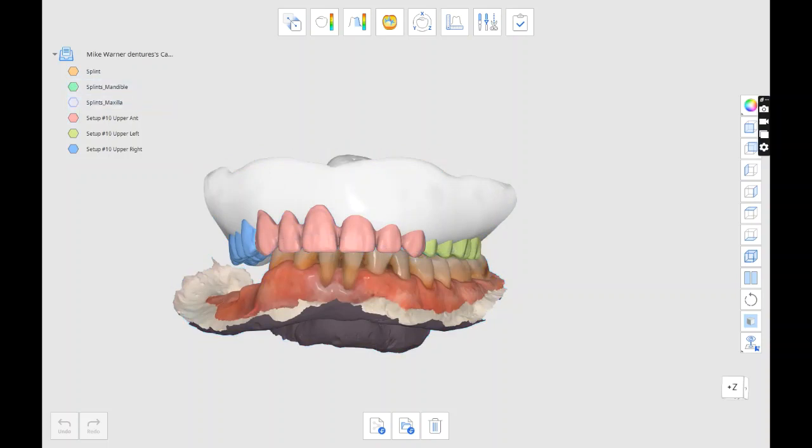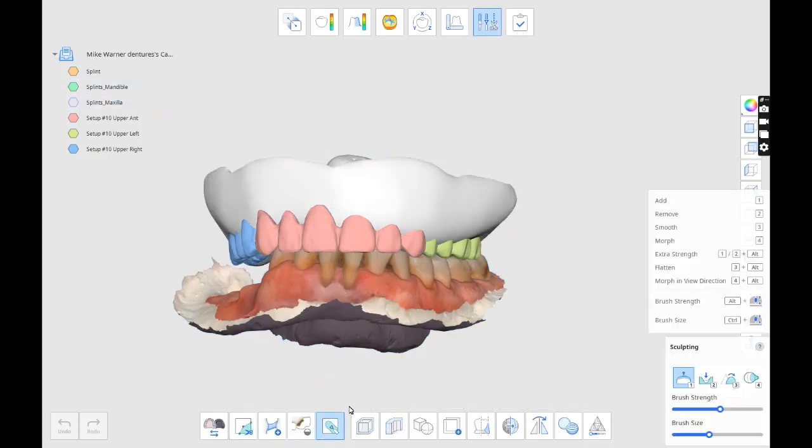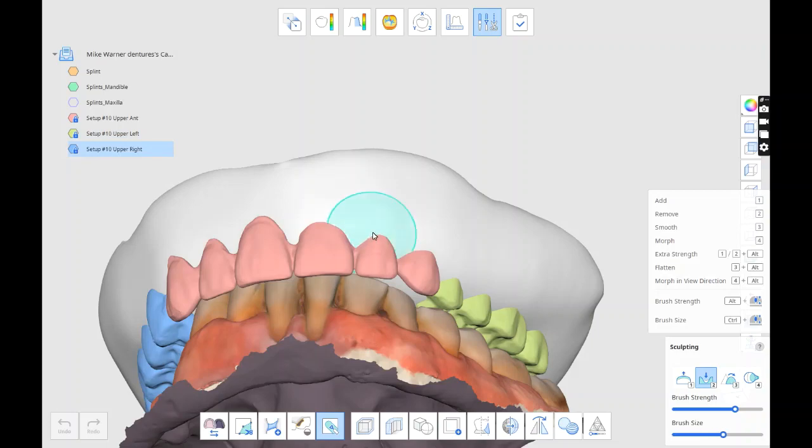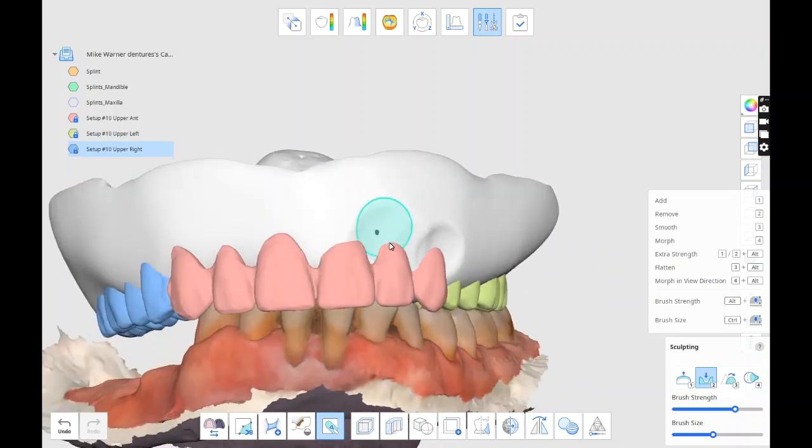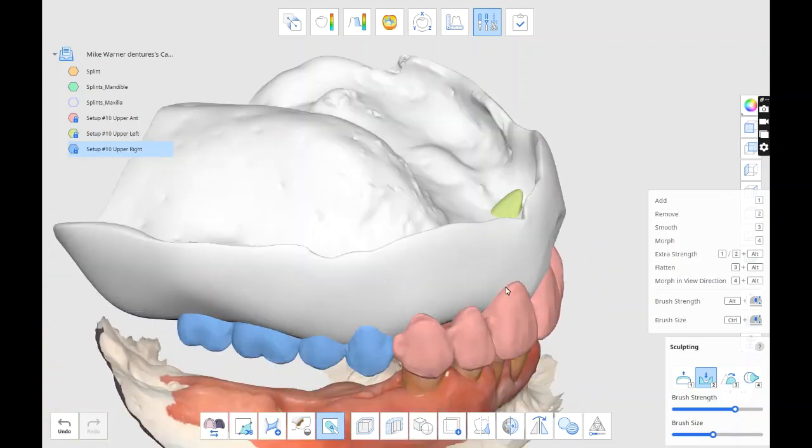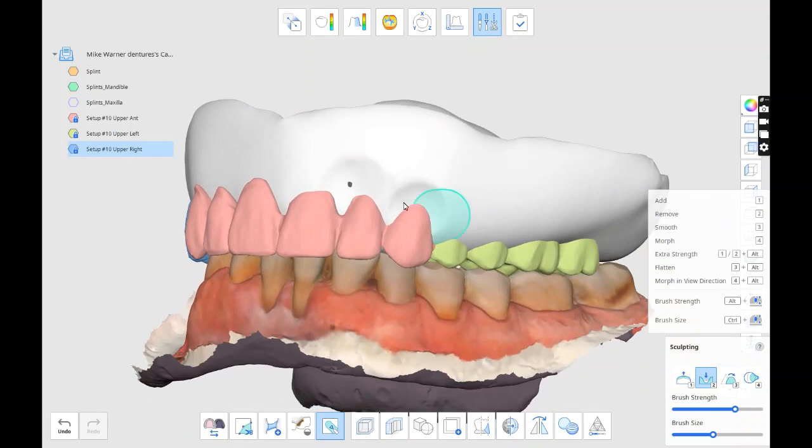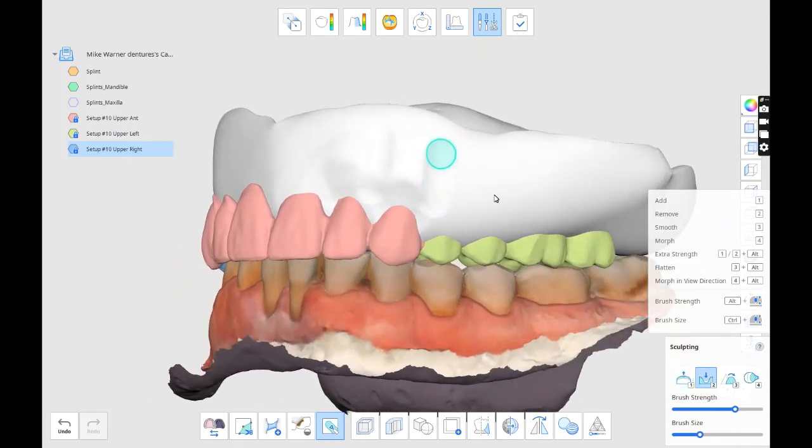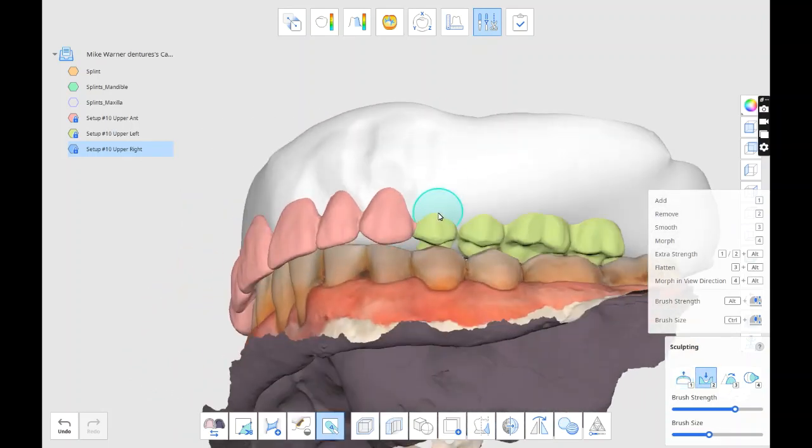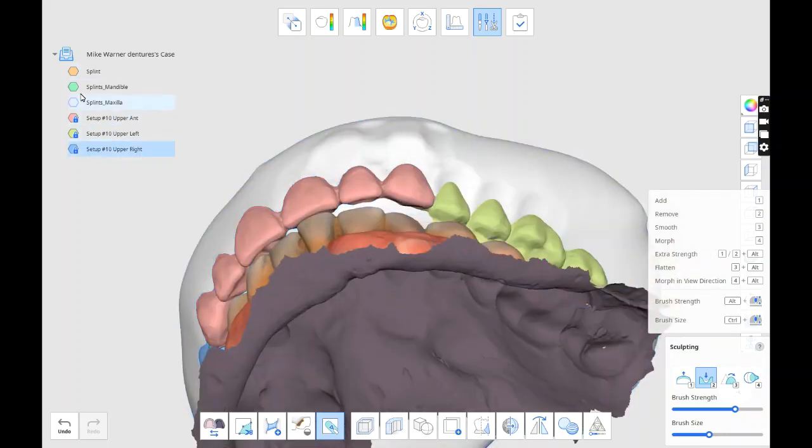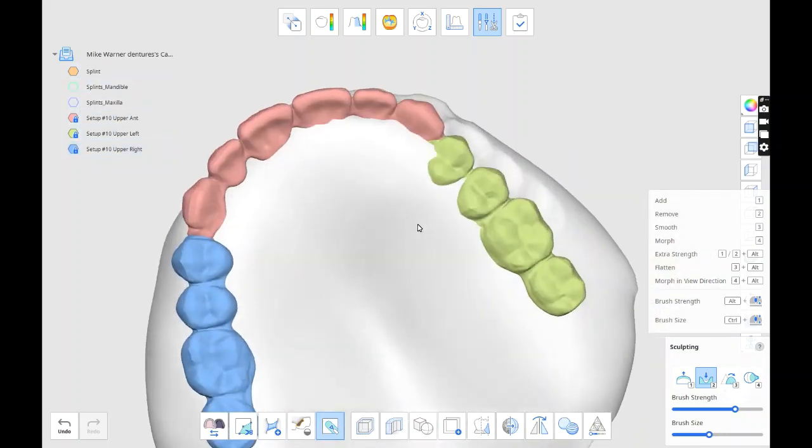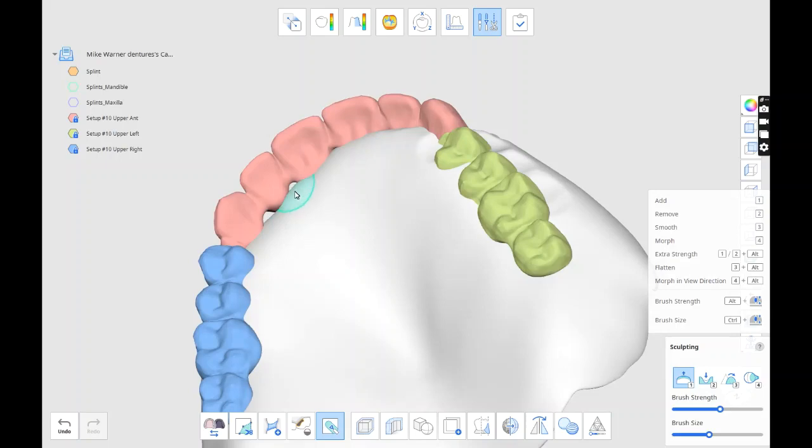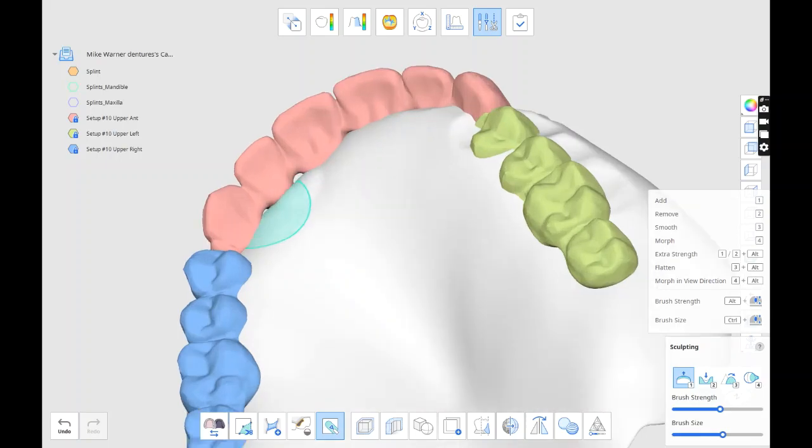So teeth are in. You can see the gums for the splint came a little too tall, so we just got to sculpt it back a little bit. And this is going to take the longest amount of time right here - sculpting in Medit Tools. I'm more familiar with Exocad, so this takes me longer, but I think with a little practice it's not going to be too difficult.